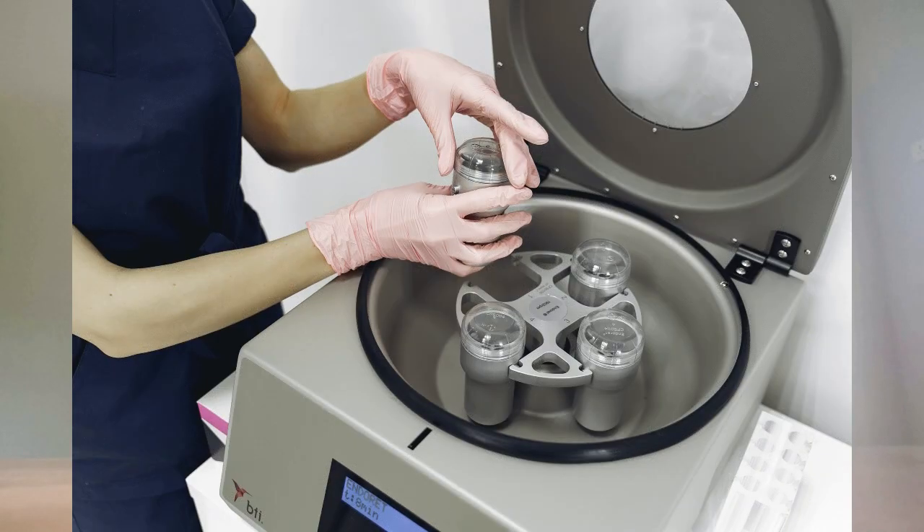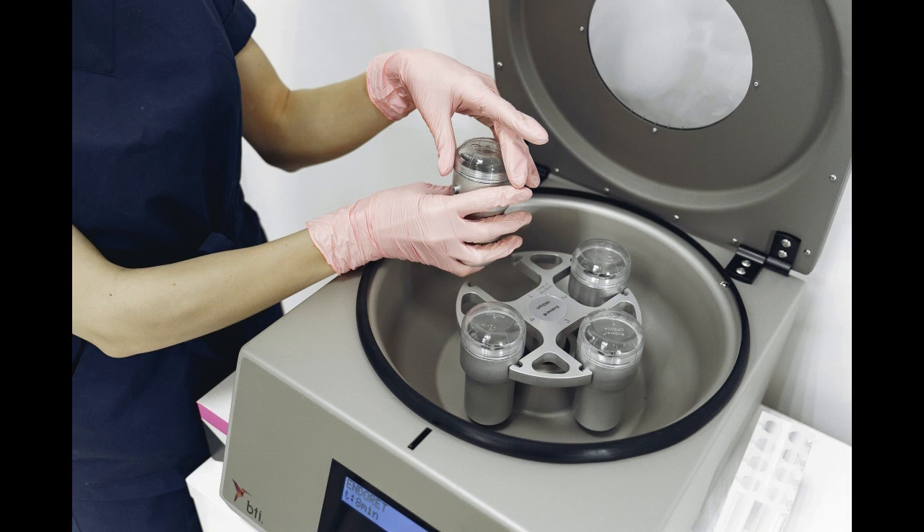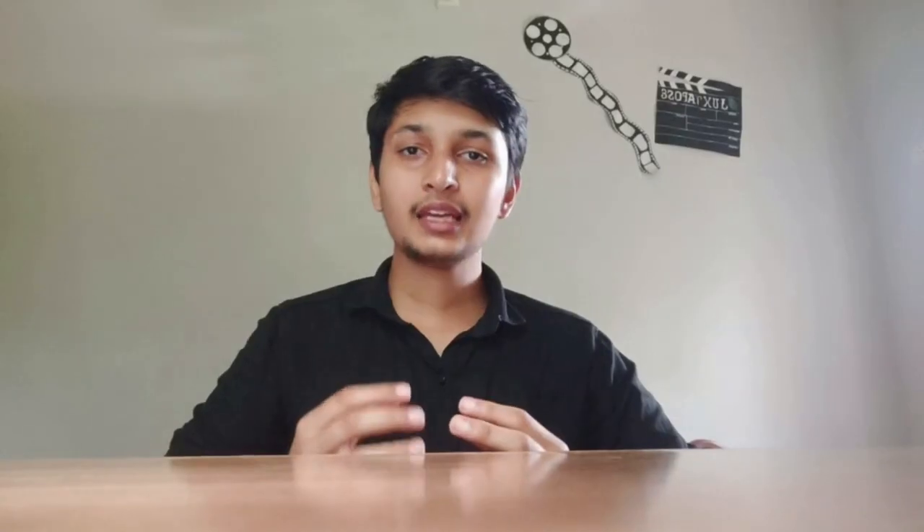We use centrifugation. We use the centrifugation machine at high RPM. From this process we extract the RNA.